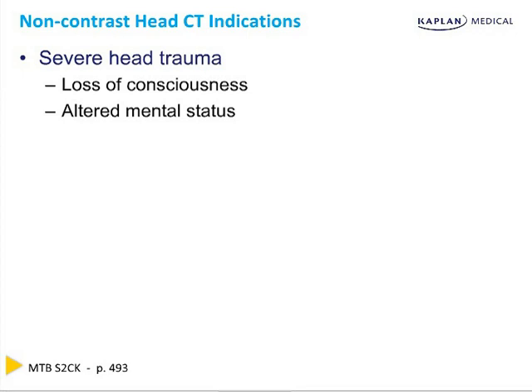The initial test for a patient suspected of having a stroke is also a non-contrast head CT. So if you are asked about a patient with unilateral weakness, slurred speech, or any of the other classic stroke symptoms, get a non-contrast head CT. Note that the CT will not only tell you if the patient is having a stroke, but can also distinguish between hemorrhagic and ischemic strokes. This is a vital piece of information because you must quickly treat patients with acute onset ischemic strokes with TPA, but doing so could kill a patient experiencing a hemorrhagic stroke.